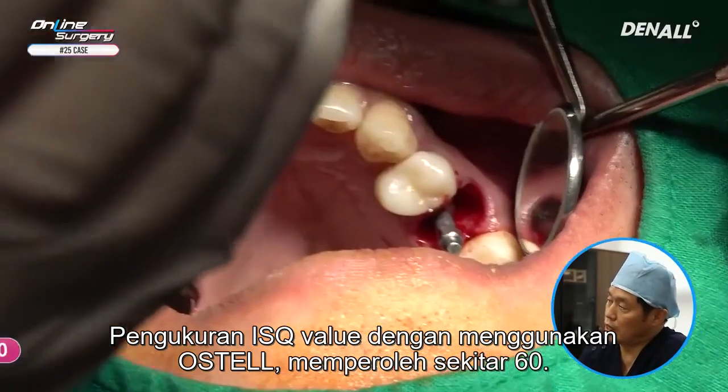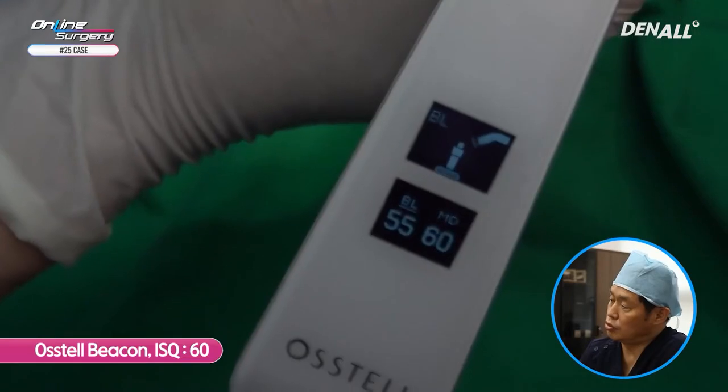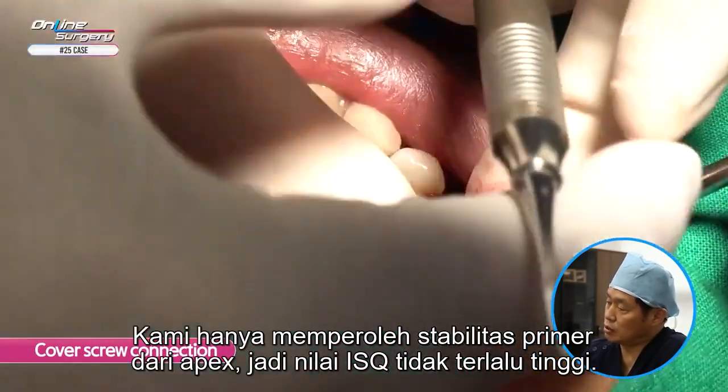ISQ value using Osstell is approximately 60. We only get primary stability from the apex, so ISQ value is not very high.